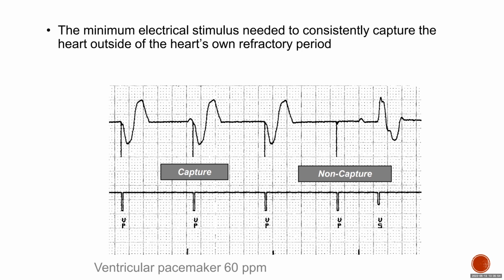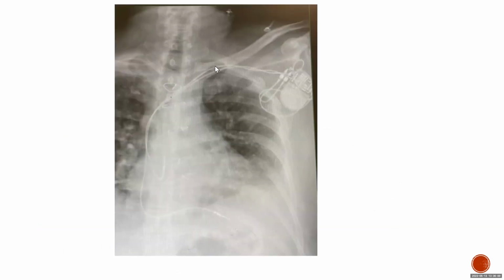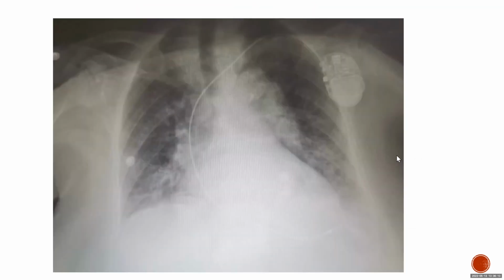Okay. So let's go back to the X-ray. Yeah, so someone said dual, right? Hassan. Good. You see that, right? And RV. What about this one?